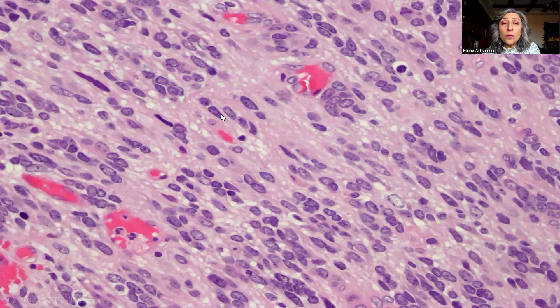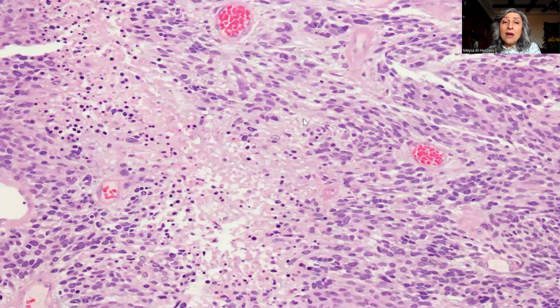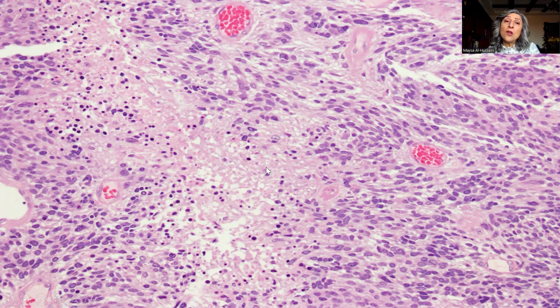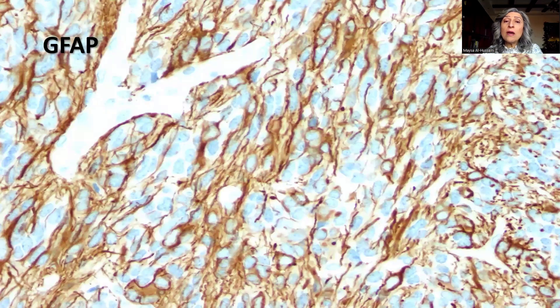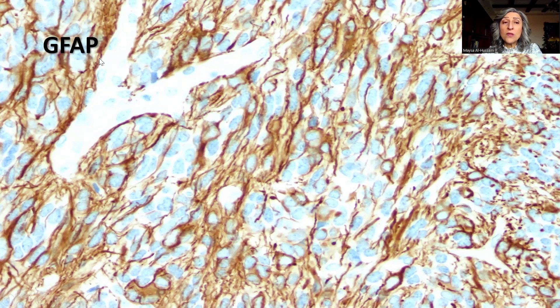In other areas there is streaming of the tumor cell nuclei with a neuropil-like appearance of pink material in the background. In one focus there was an area of necrosis, in particular palisading necrosis. At this stage, the question was whether this is a high-grade glioma or ependymoma.